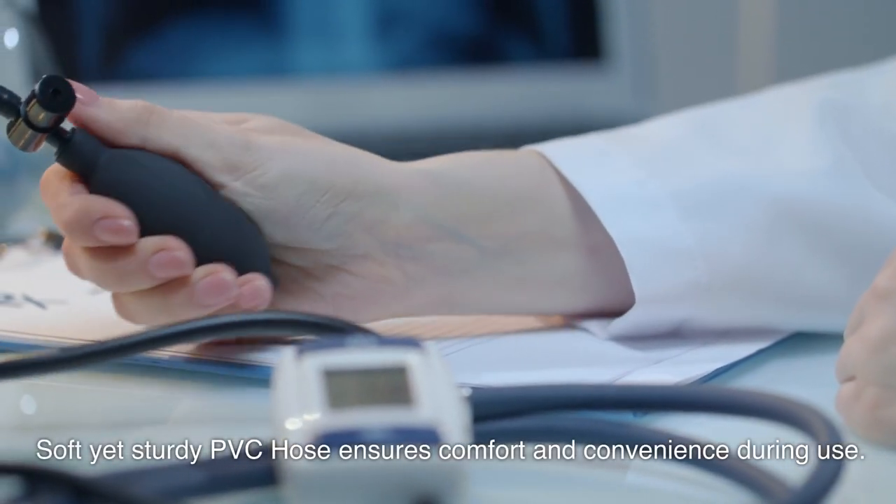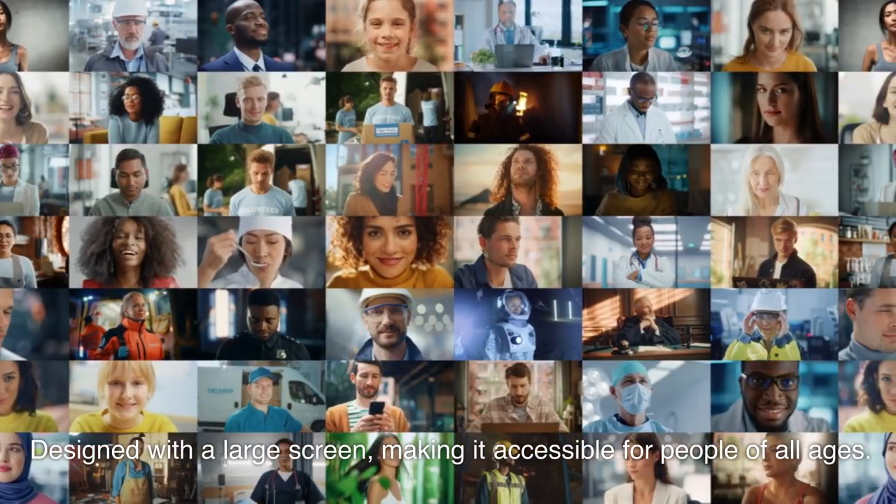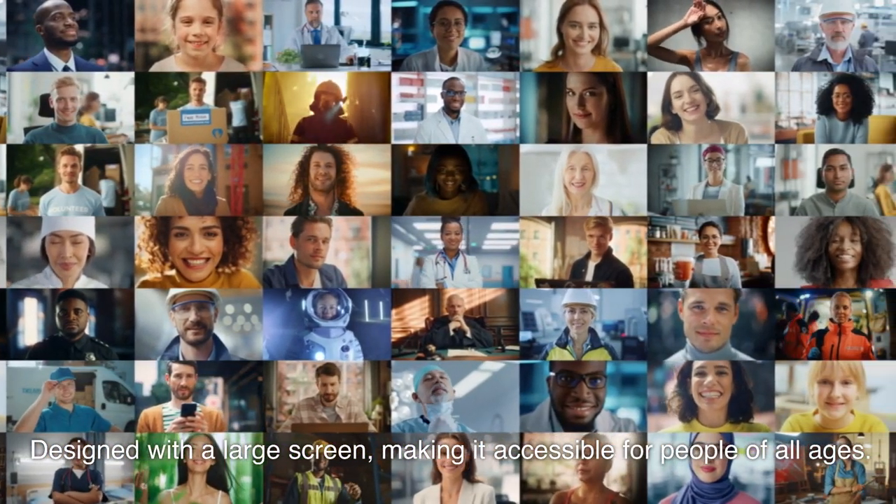Soft yet sturdy PVC hose ensures comfort and convenience during use. Designed with a large screen, making it accessible for people of all ages.